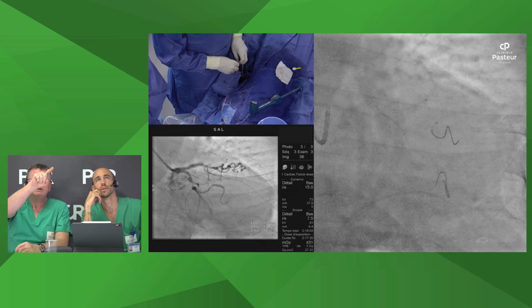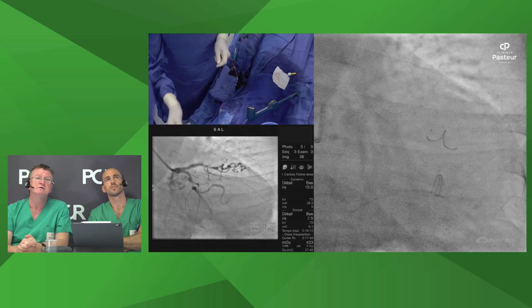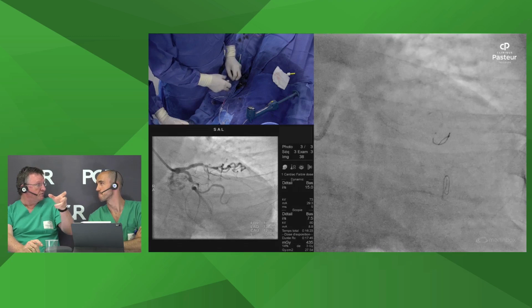You know, the calcification makes it rigid and non-compliant in the proximal vessel. And then you have tortuosity. So tracking things down there will always be challenging for anybody, I think. For this kind of lesion with circ, do you use an Amplatz guiding catheter or not? It would depend. If the left main stem is quite short, an Amplatz guiding catheter is perfect because you can pull it back and point the tip down selectively into the circumflex.